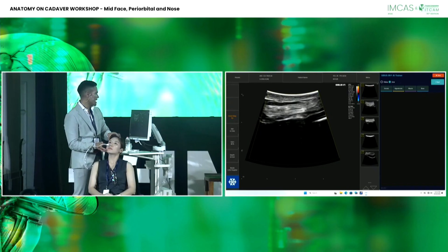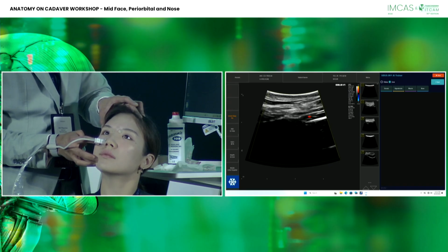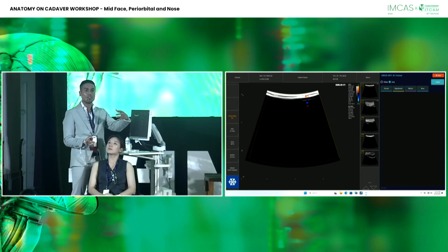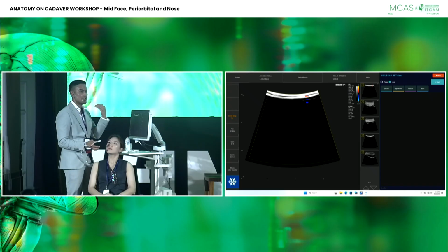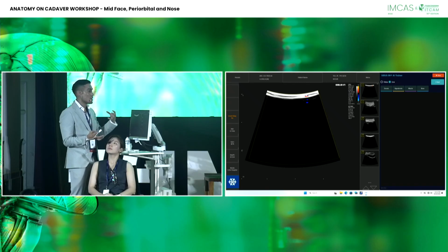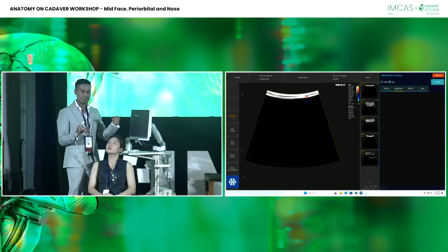Here you go. You see the gap. You go a little bit closer. You see the vessels. So I want to keep my injection instrument away from it because the problem is when you overdo injections here, the filler is going to accumulate around that foramina. We have many different foraminas around the face, periorbitally especially, and that can cause pressure. Overaccumulation causes malar edema because the venous outflow is compromised here, right?